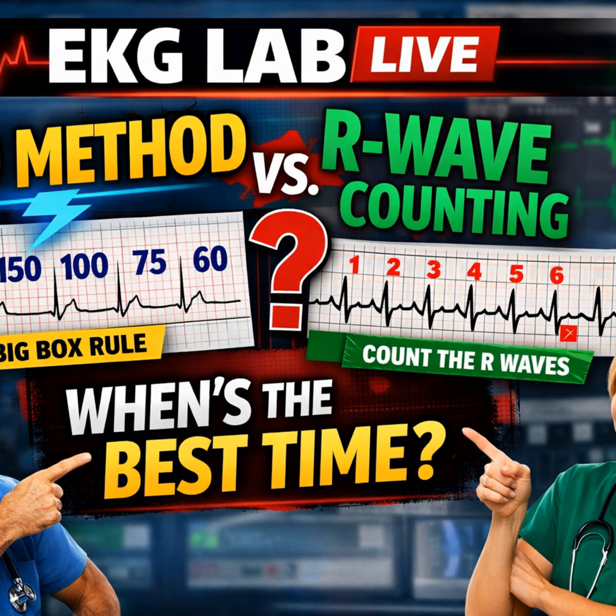I'm sorry, but if a patient is unstable, hypotensive, chest pain, crashing, I am not measuring RR variability to the millisecond. The guidelines are clear. Unstable with a wide complex tachycardia, you cardiovert. That is the ACLS algorithm, yes. The nuance you're talking about is for the stable patient. In the crash scenario, the strip method aligns with the survival brain. It gives you a good enough number to act on immediately.